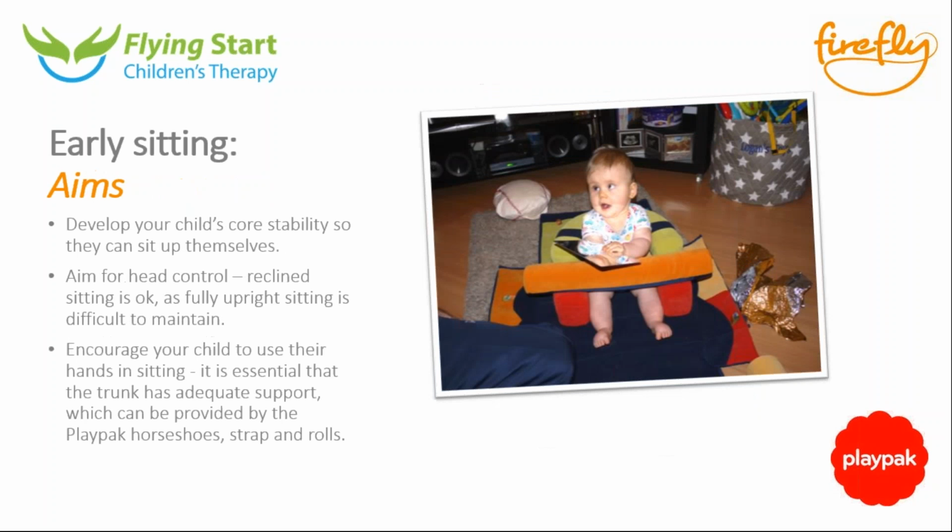So next slide. What we're really aiming for in the early sitting is to develop the core stability and the head control so that they can comfortably slide the bottom back to a more upright sitting posture, because obviously being reclined isn't the functional, playful sitting that we would want and aim for. So it's just to slowly progress them back so that they're more upright, with more head control and arms coming forwards, so that they're actually able to use their hands with toys at their legs.